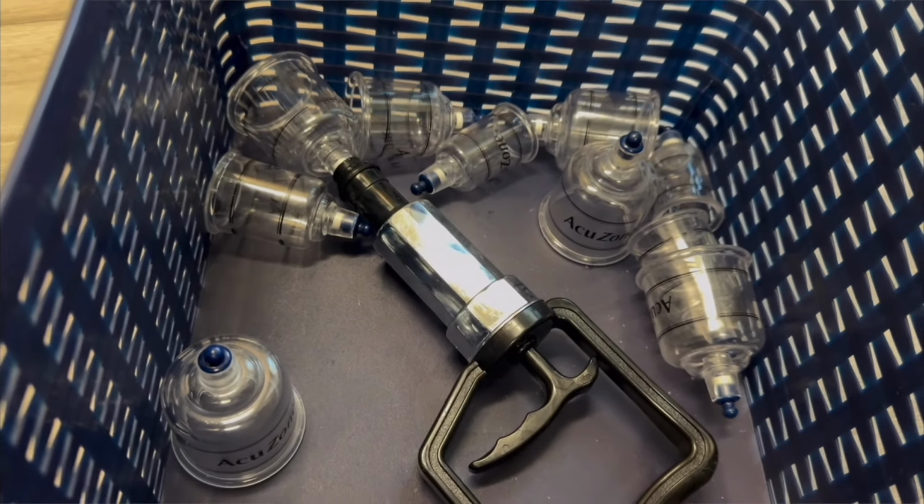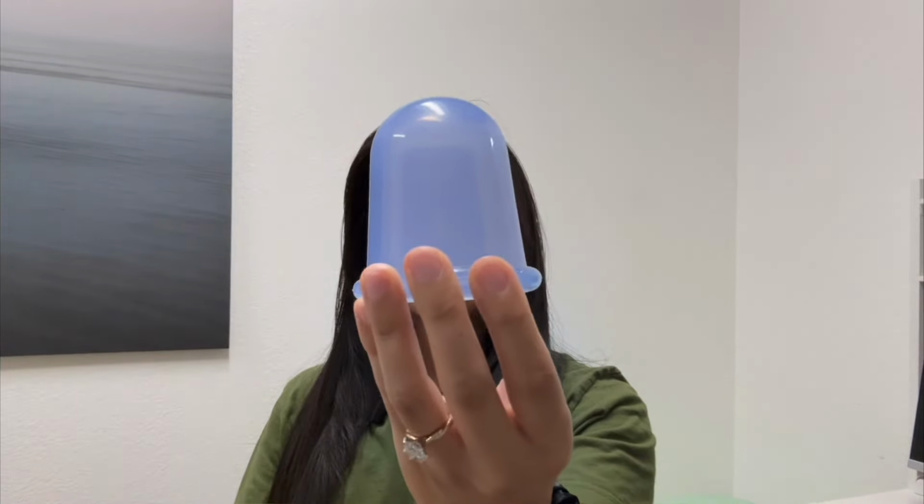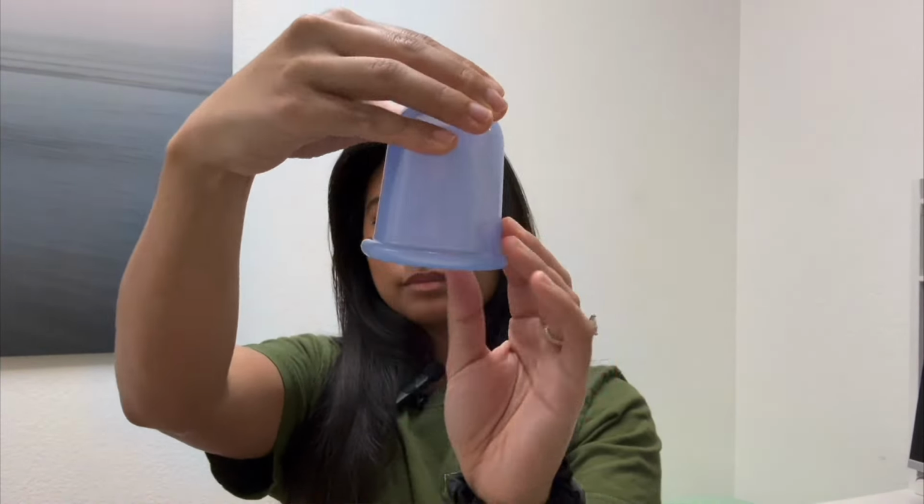The plastic cups typically come with a pump suction device that almost looks like a little gun. The silicone cups do not have the pump suction device or any of the valves, so you're able to just squeeze it to use it. Some differences about the silicone versus the plastic cups: I feel that with the plastic cups, since there is a pump suction device to help intensify or decrease the tension of the pressure used, this is a good option for those who might want more intense decompression, or also the option to decrease the intensity of the decompression.